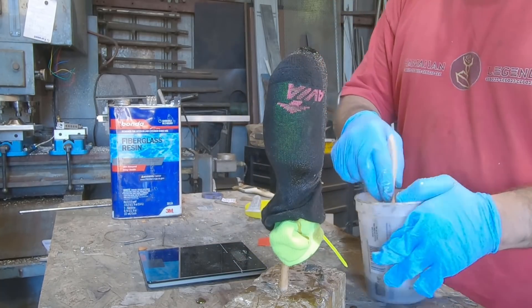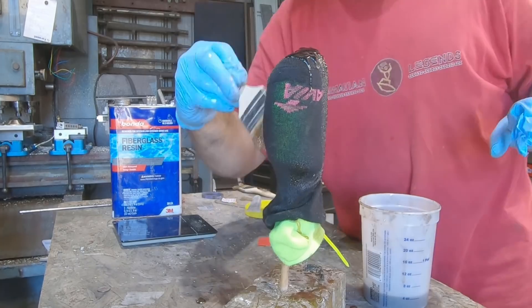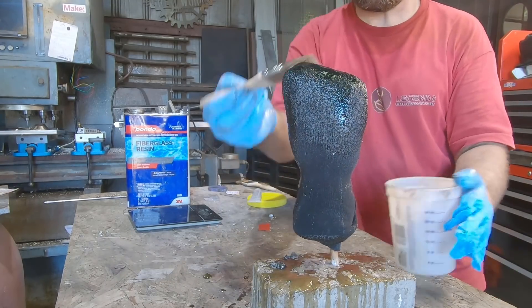On the last sock, if you have extra resin, just keep putting it on until it starts to gel. Once you're out of socks and resin, let it set for 3 or 4 hours — or overnight if you have the time — to harden and fully cure.